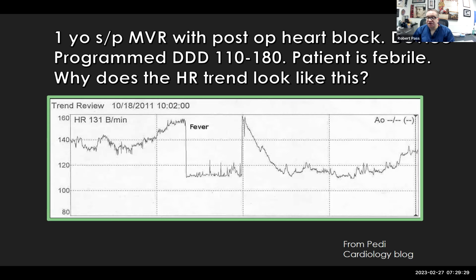So what we could do here is, first of all, raise the tracking rate faster than 180. Now, in the bedside pacemakers, the PVARP and all those other timing mechanisms are automatically adjusted downward as you increase the tracking rate. Interestingly, on permanent pacemakers, they do not change those. So you can program somebody through their permanent pacemaker 110 to 180.